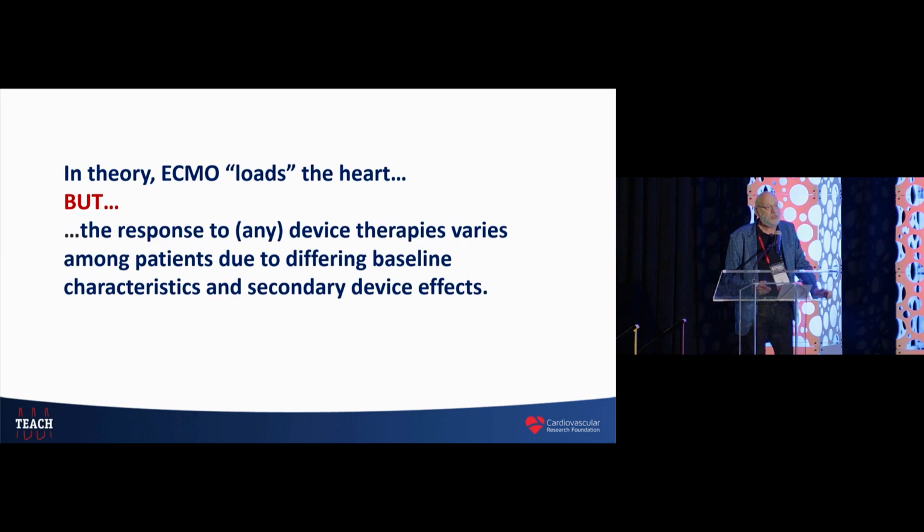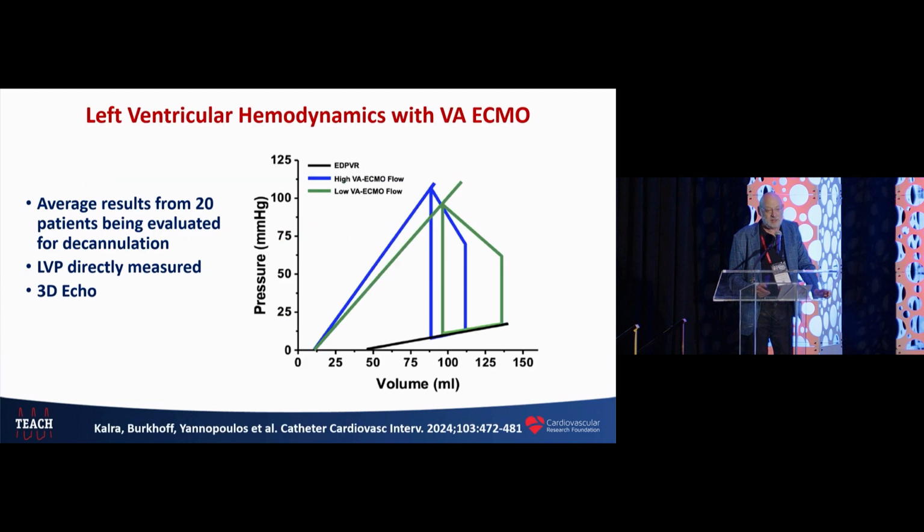So who to unload is another major question. And as we've already seen, in theory, ECMO loads the heart, in theory. But as you all know, the response to any device therapy varies significantly among patients due to baseline characteristics and secondary device effects.